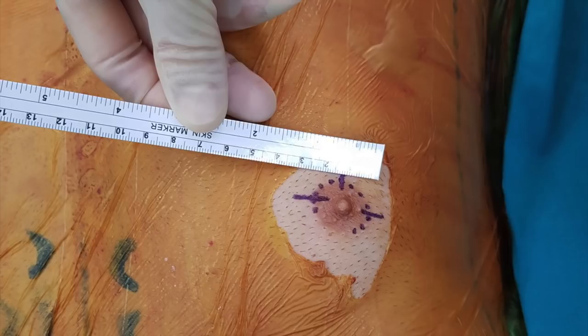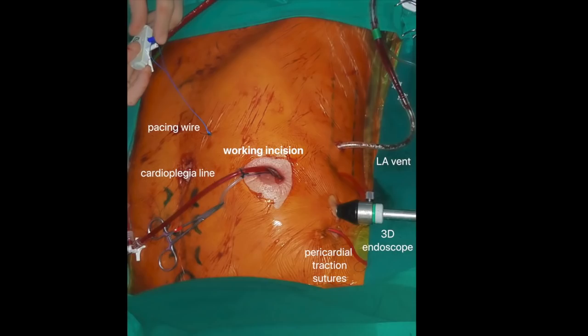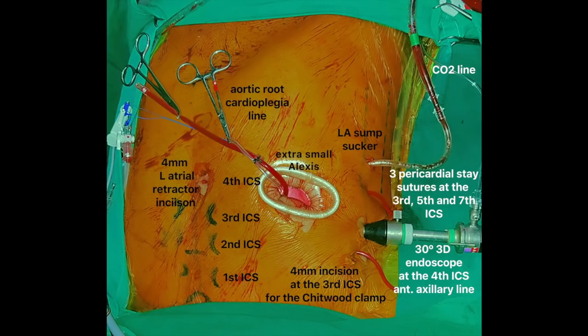Our incision is a 3 cm periareola incision to enter the thoracic cavity through the 4th intercostal space. The 3D endoscope was inserted through a different incision in the same intercostal space in the right anterior axillary line. To enlarge the working incision and also to protect the wound margins, the extra small Alexis wound protector is inserted in the 4th intercostal space.